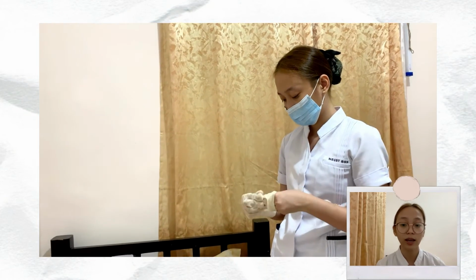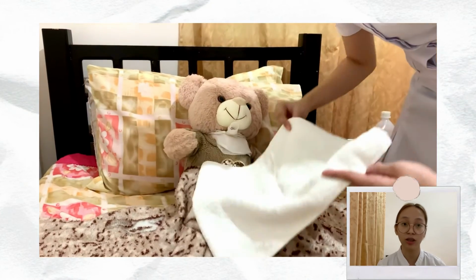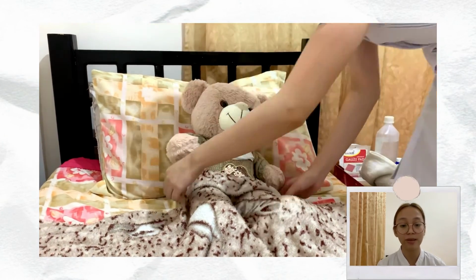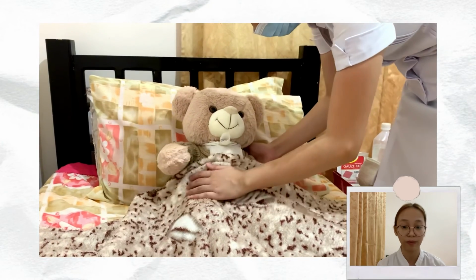Number 20, remove gloves, assist patient to a comfortable position, raise the bed rail, and place the bed in the lowest position. Number 21, remove additional PPE if used, perform hand hygiene, and document. Number 22, reassess patient's respiratory status, including respiratory rate, effort, oxygen saturation, and lung sounds.